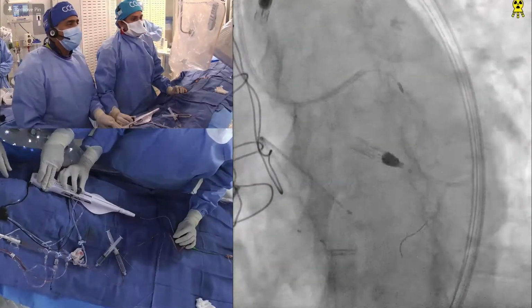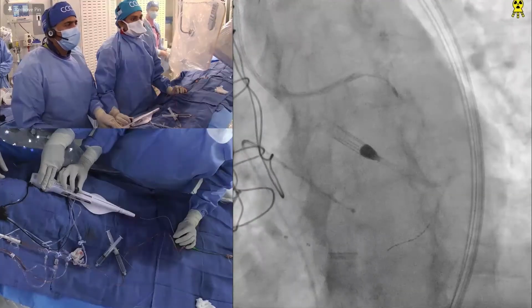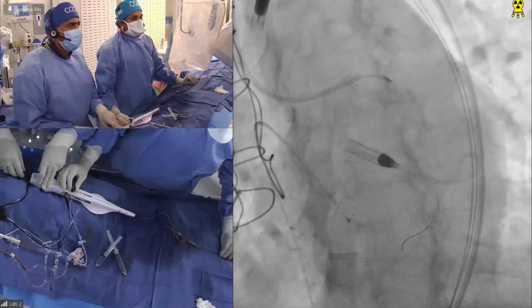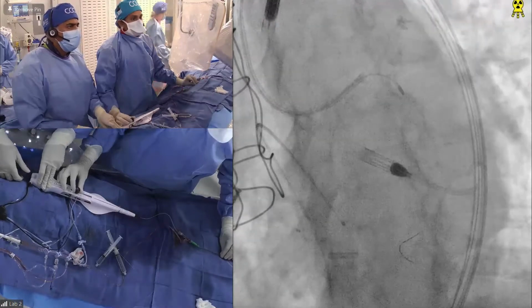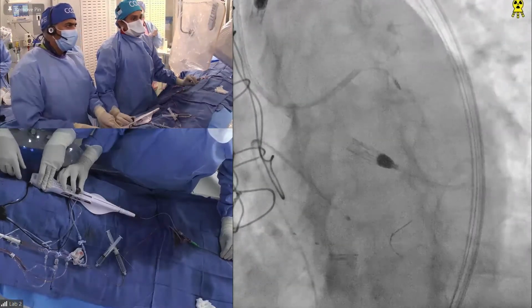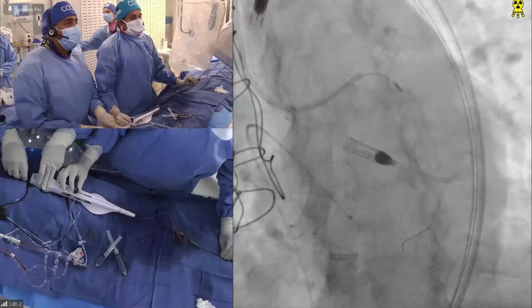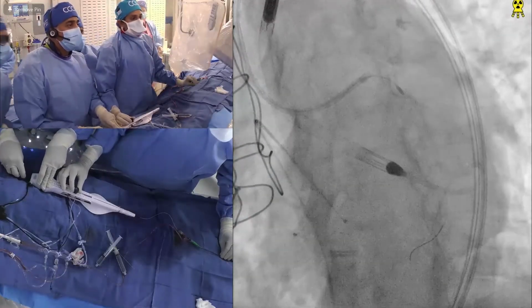This is a crucial point. We hear the screeches of the machine slowing down with this burr. Yeah, changing wire position too is important. What Nitin is saying, he is changing the wire position.